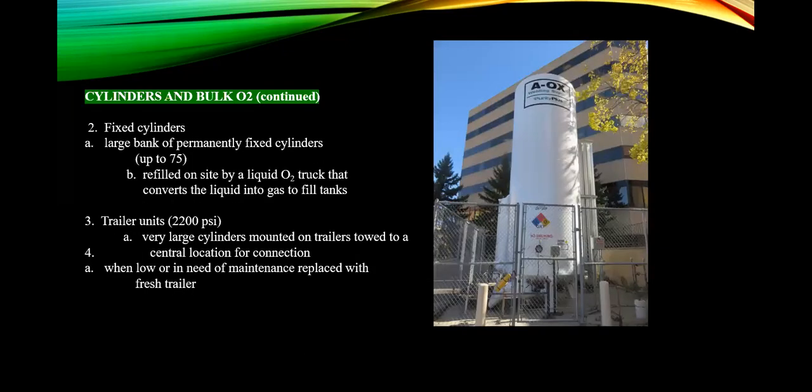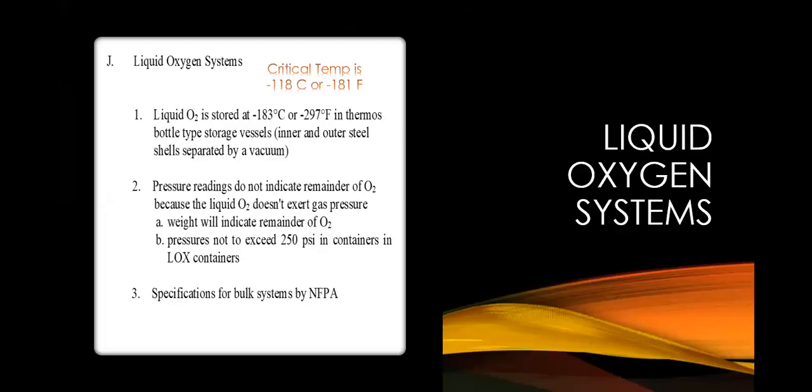Just know that outside your hospital, there will be a liquid O2 system, and it will be filled up by the liquid O2 driver. He or she will come and fill up the liquid tank that's outside, and it will be stored at about negative 183, so well below the critical temperature, right? If somebody told you that you got to store this meat at 20 degrees Fahrenheit or it's going to go bad and kill your family.